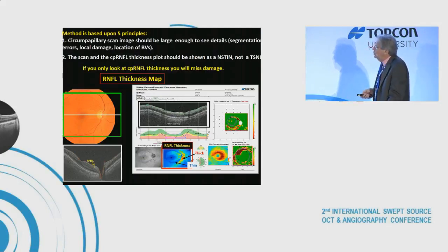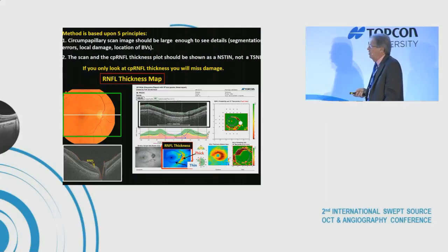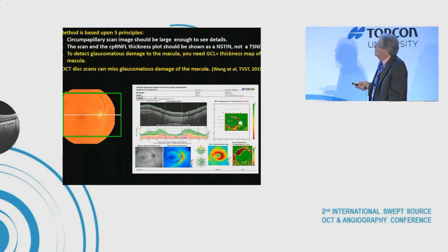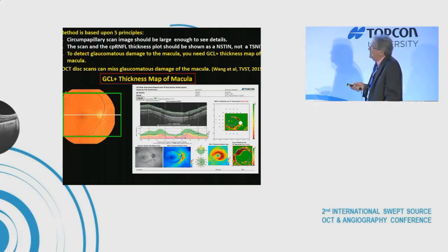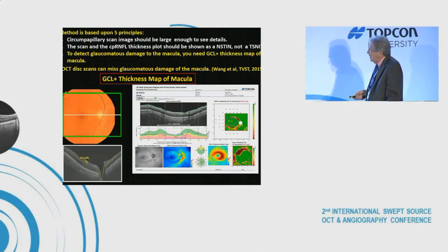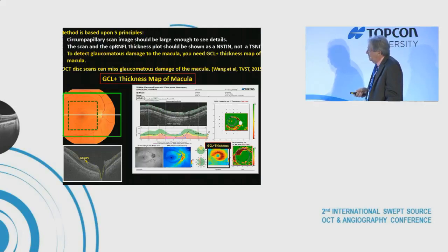If you only look at the retinal nerve fiber layer thickness, you're going to miss some macular damage. That's why we strongly advocate also looking at ganglion cells in the macula. We include a ganglion cell plus inner plexiform layer thickness map of the macula — showing this layer across the scan. Again, dark red is thick, dark blue is thin, with the foveal center visible.